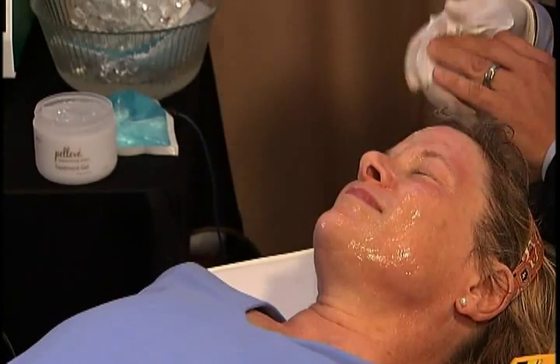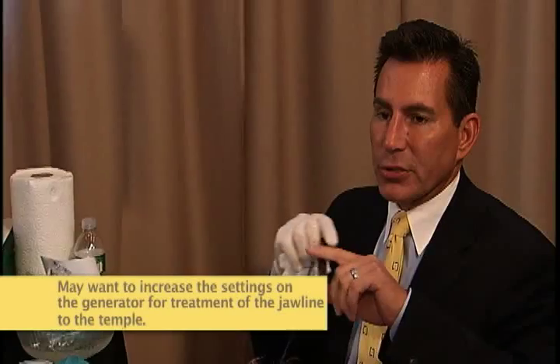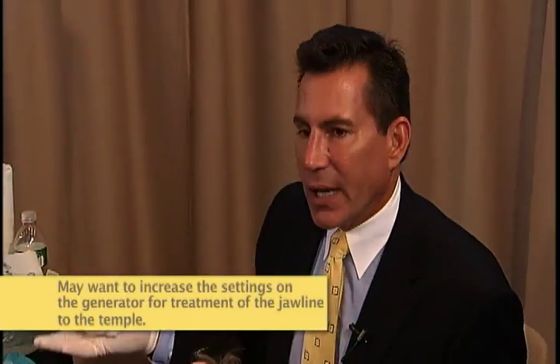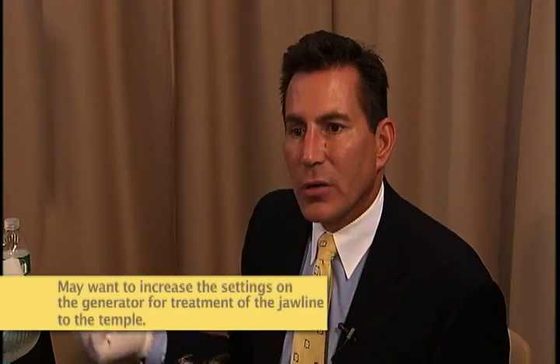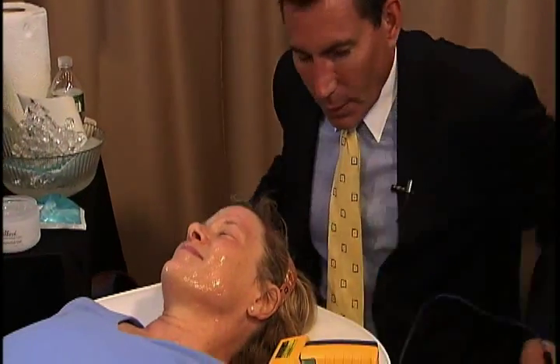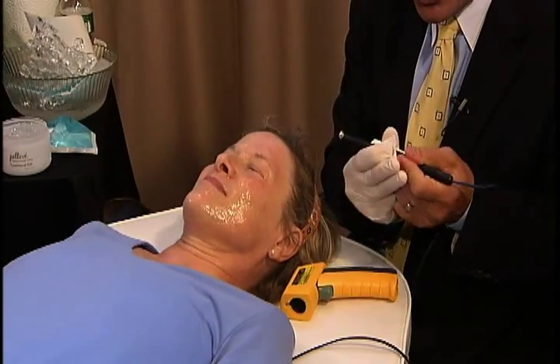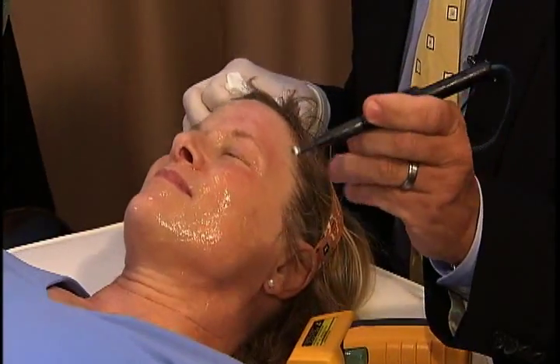Okay, so I turned the, she was treated at 18, which is a relatively low temperature for the forehead. She's a small person, so I'm going to start at 28 with her, whereas I might start at 34 or so on John, for instance. And again, you want to find a temperature where you can work at a reasonable speed so you don't take too long, but where you're just not hurting the patient.